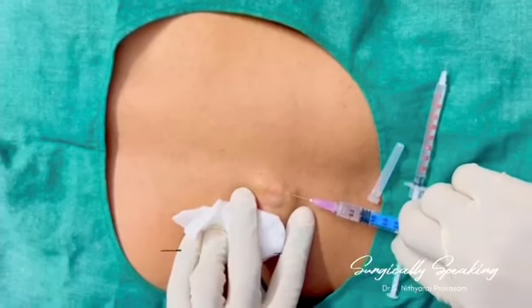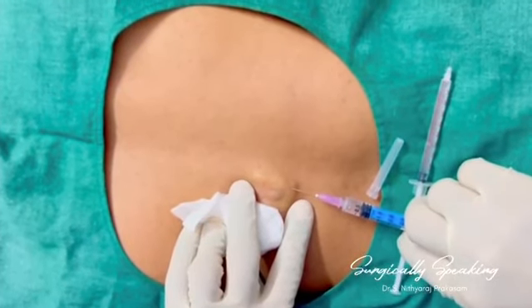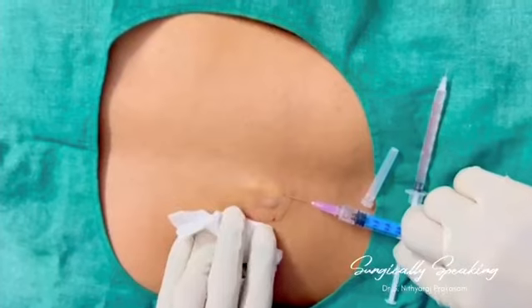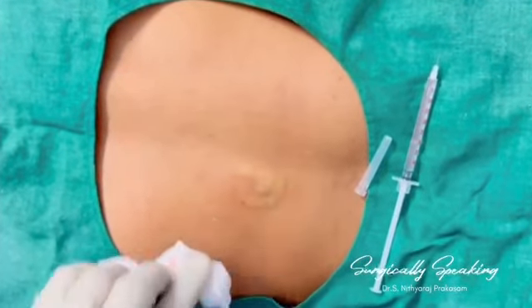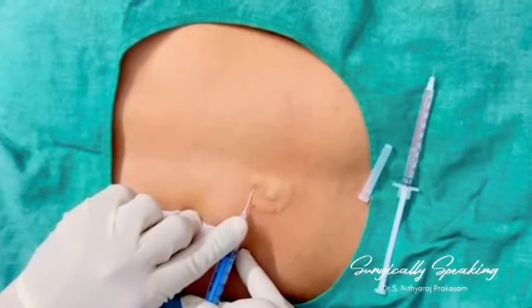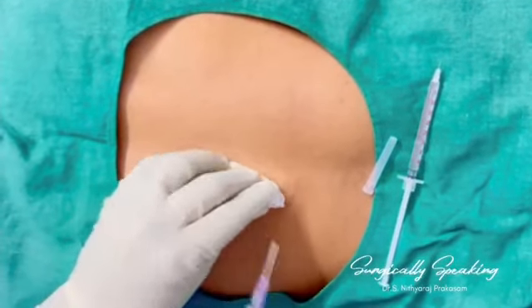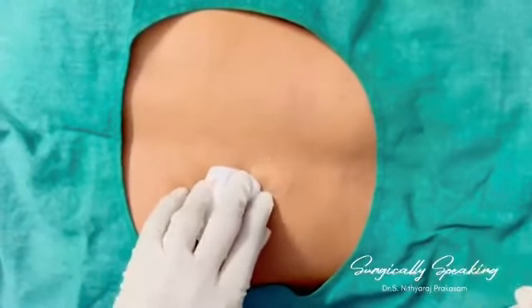So infiltrate. As you inject, withdraw and watch for the wheal being raised. Now last. Yes, we are done there.